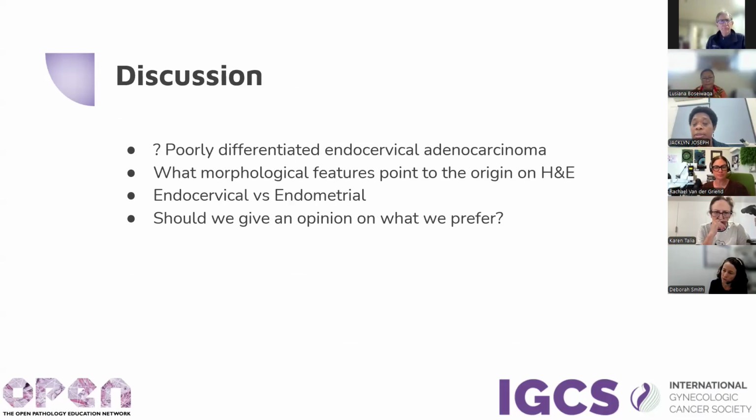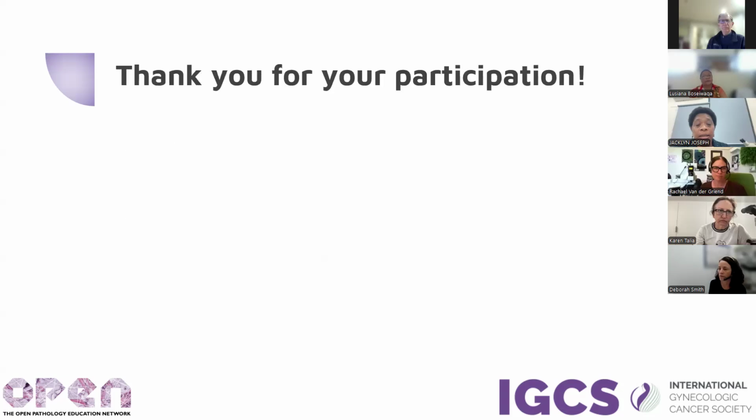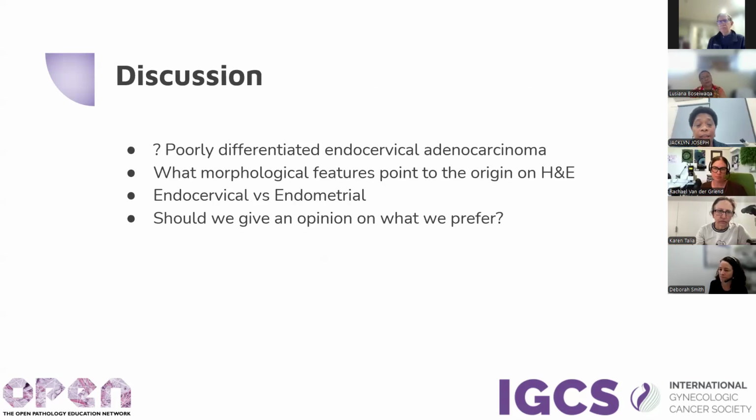I think that's all. The discussion was mainly the morphological features that point to the origin on H&E. I know that's quite difficult, but thank you to the mentors who pointed out the salt and pepper type nuclear chromatin and the nuclear molding. Also, should we give an opinion? We have our differentials there, but should we give an opinion on what we prefer? Thank you. That's all for the first case.